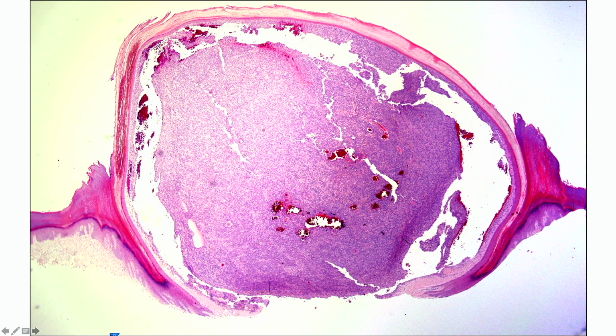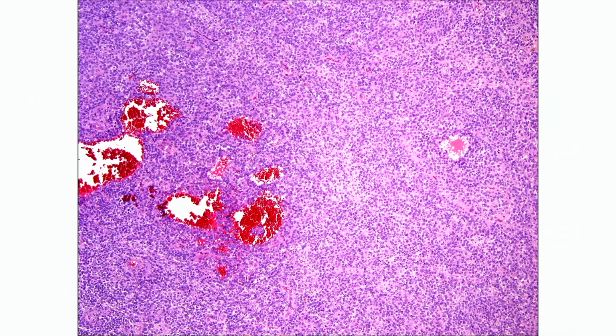So we have this polypoid lesion on the hand, and you can see it's got this sort of sheet-like proliferation of small round blue cells. And I'm thinking, okay, and you see these ectatic vessels. I'm a pretty young dermatopathologist. I think I can figure this case out, right?